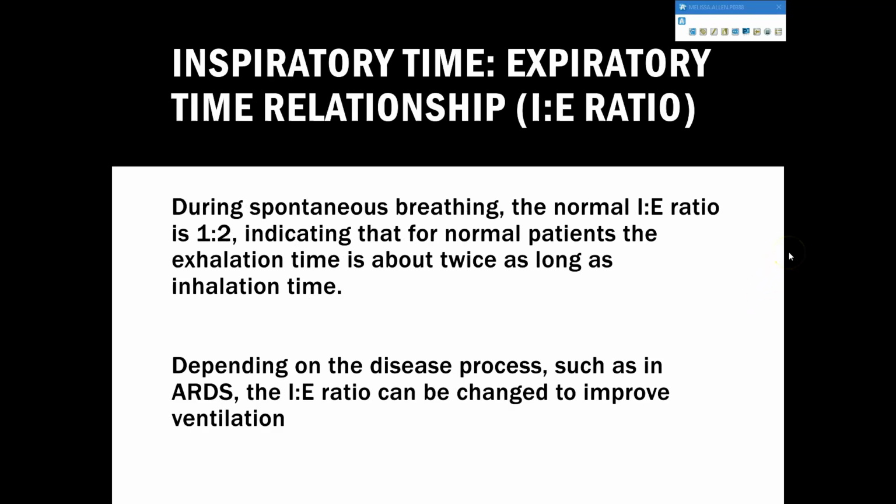Okay, so let's go back into IE ratios. So we really want to look at our IE ratios. This is something that no one else is really paying attention to. It is our responsibility to make sure that we are giving that patient a normal IE ratio, which we already said is at least 1 to 2. And think about it, if you were to take a breath, your exhalation would be at least twice as long as your inhalation.